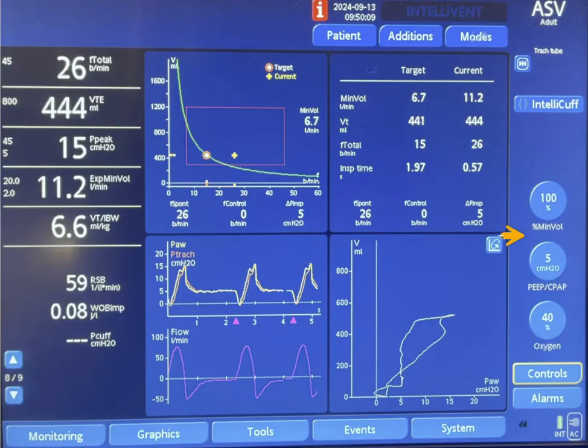As you know in this mode we target minute ventilation and we decided here that we want the patient to get 100% of the minute ventilation. So the machine is set to deliver a minute ventilation of 100% of his needs.